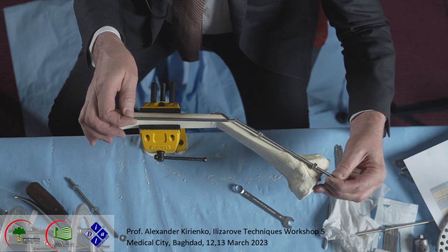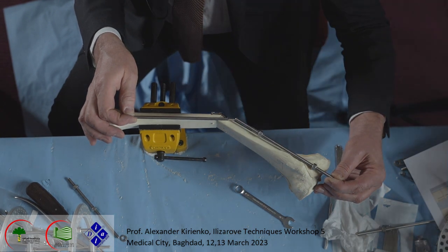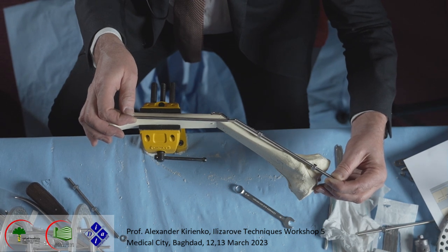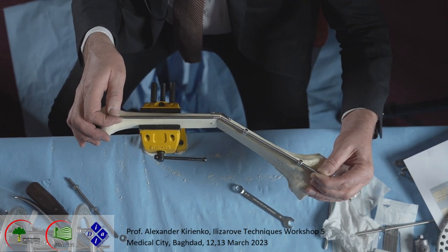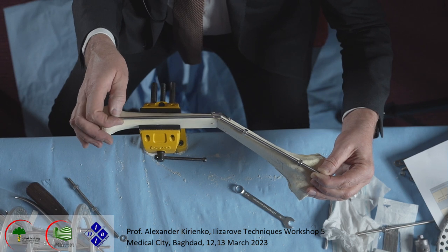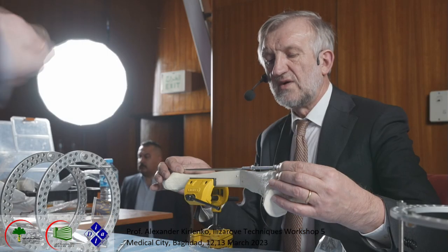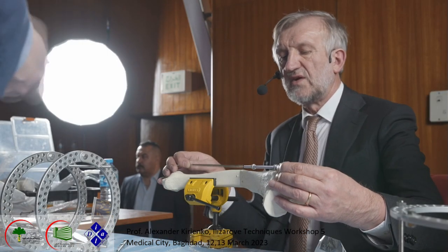Apparently the fracture was below, but the real deformity is at the level where the anatomical axes cross. Now we studied it really well. There is no displacement, it's only angulation, a simple deformity with angulation in varus at the level of the previous fracture here.